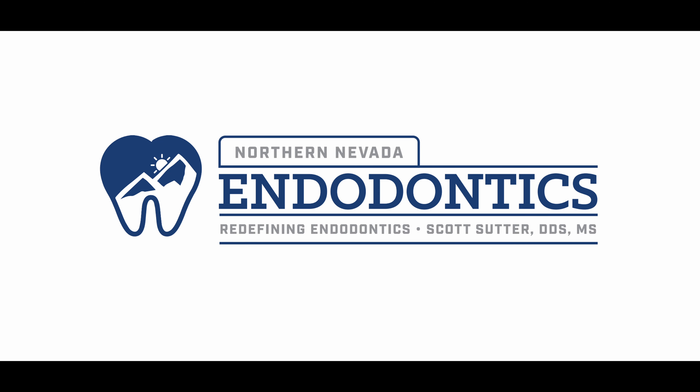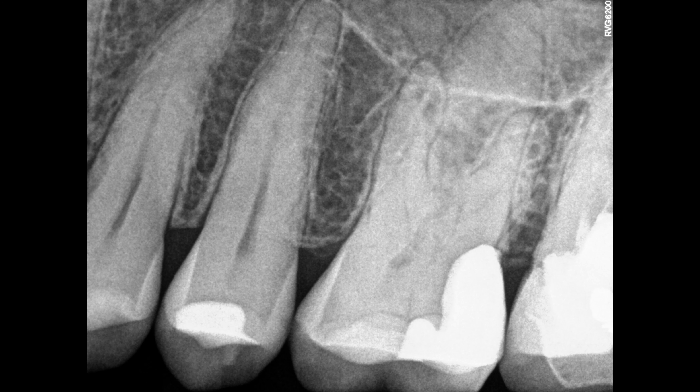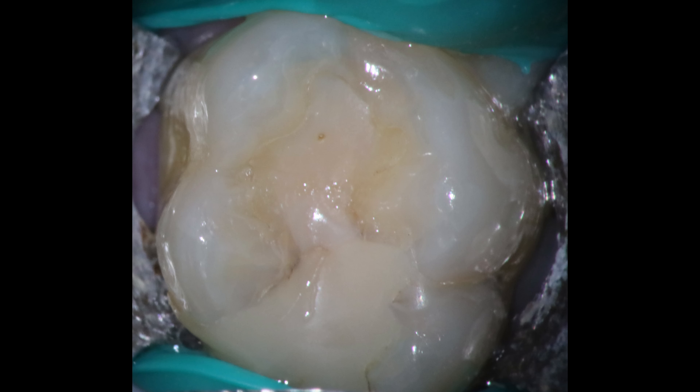Hello everyone and welcome back. I know we've been waiting for this one for a long time, so we're going to do a hand filing one. I'm actually not working on 15 — it's actually 14 today. 15 is still somehow totally fine, but 14, I thought this was a good one. A little bit of calcification there, definitely infected, and that's what it looks like from the coronal aspect.